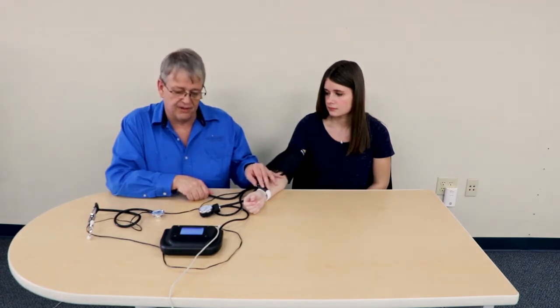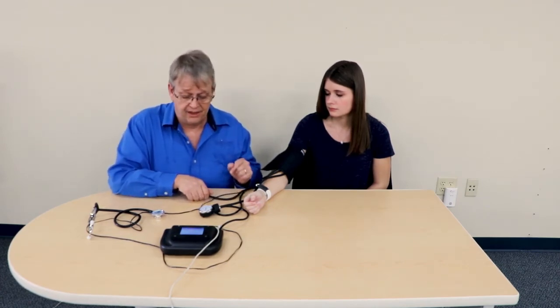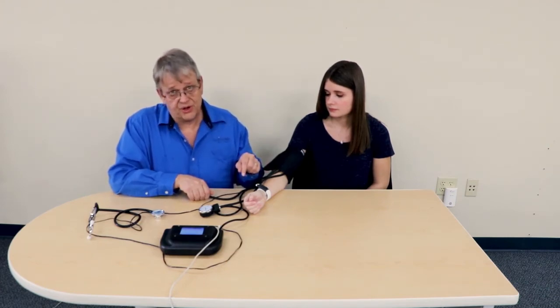Here's the Korotkoff II sound — I still feel the pulse. At 102, notice the sound went away even though I can still feel the pulse. We are now in the auscultation gap. I lower it until we're at 97 and the Korotkoff III sound is now playing. I lower a little bit more and Korotkoff IV sounds. Once the sound goes away, that's the diastolic, and that's at 80. So this reading was 120 over 80 with an auscultation gap from 102.5 to 97.5.